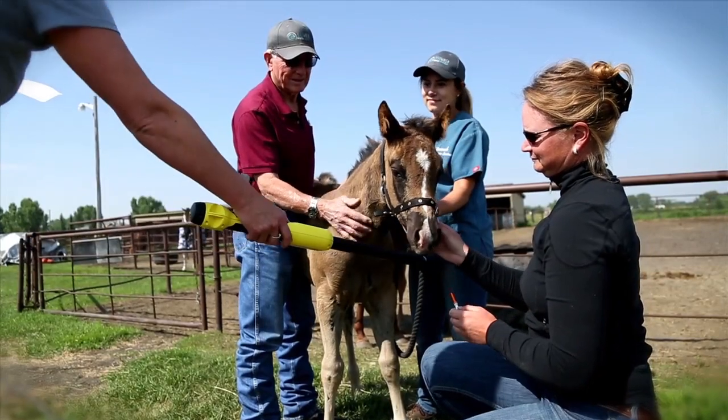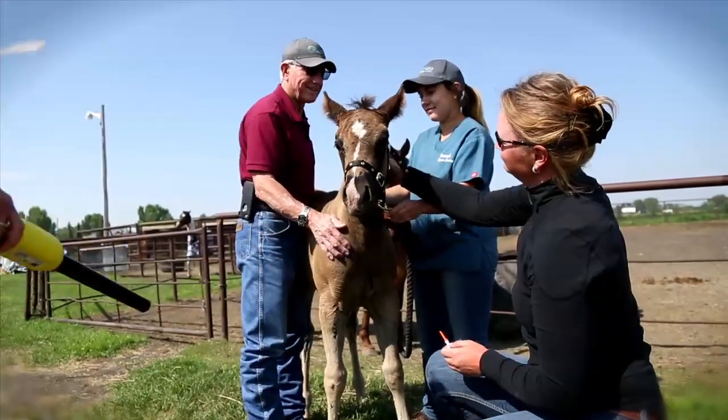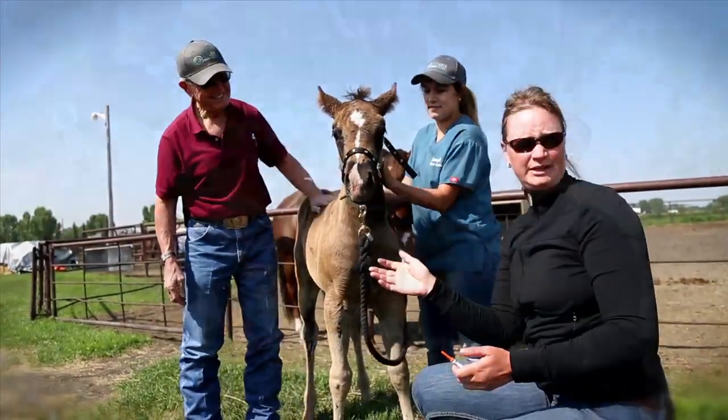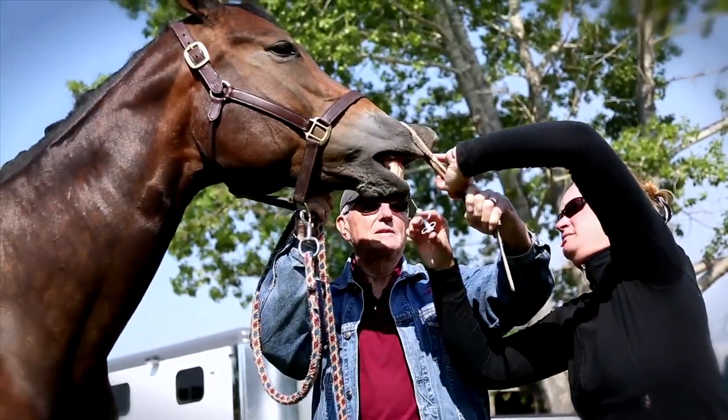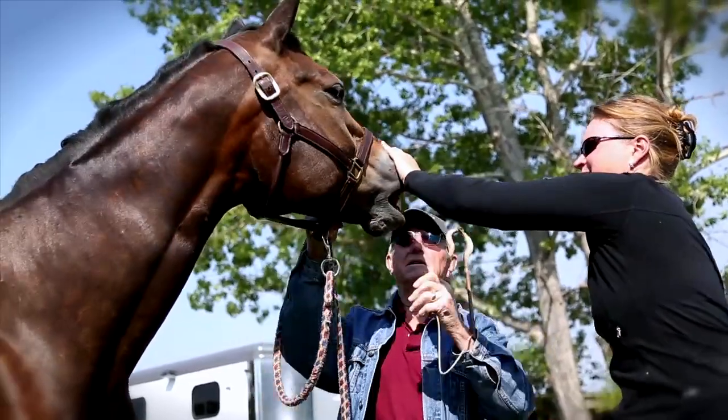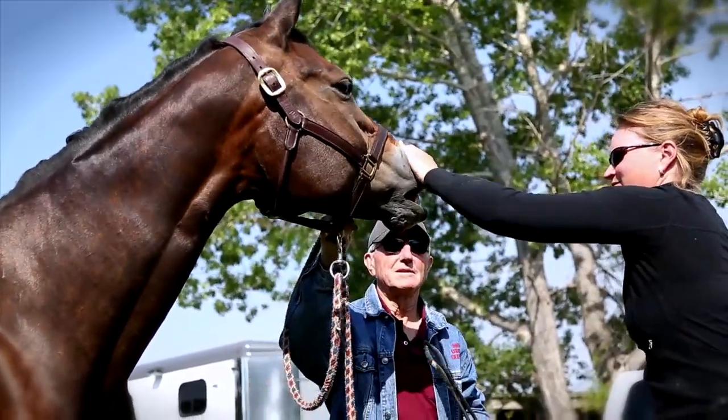The nasal implant location can be quite easy to perform once a person has been trained. We believe that anyone comfortable with giving intravenous injections and with average to above average equine handling skills will be able to easily microchip equines.